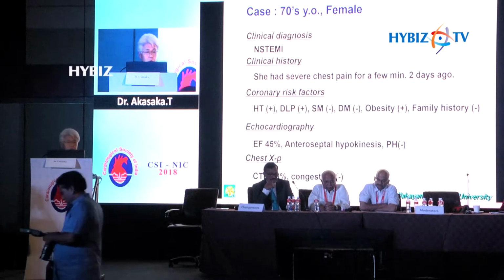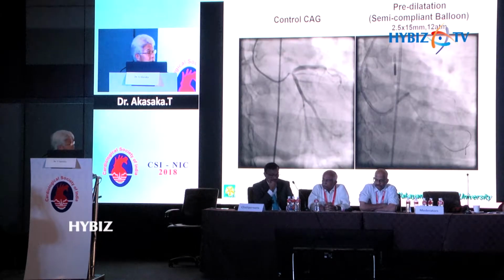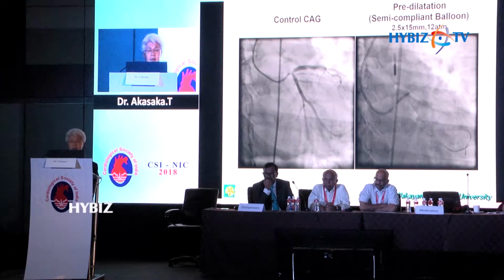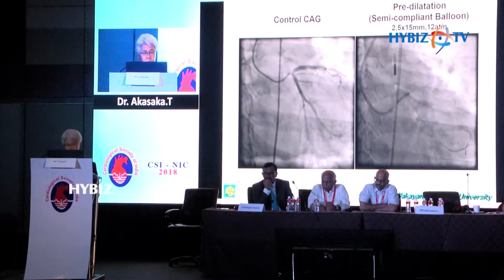I will try to show you one case, a 70-year-old female, a non-STEMI case. This is a still frame of the angio. There are significant left main and bifurcation stenoses. When we treated the patient, we put in an IABP in this case.